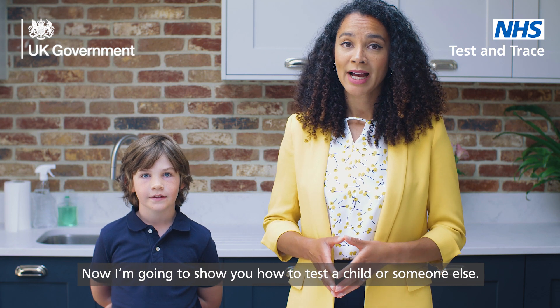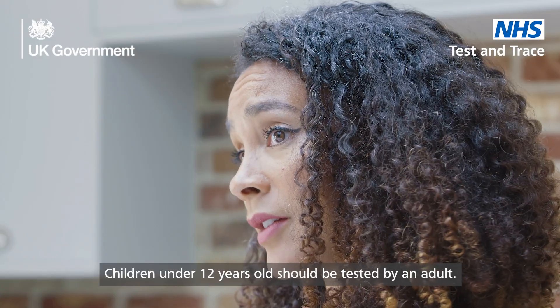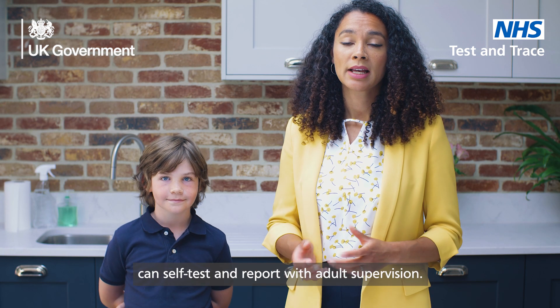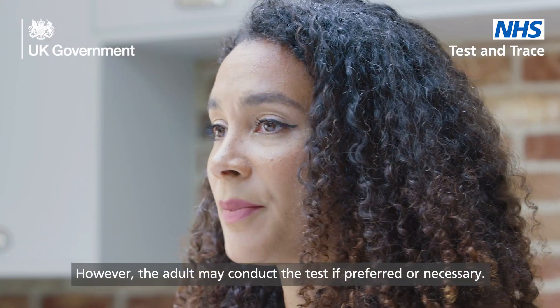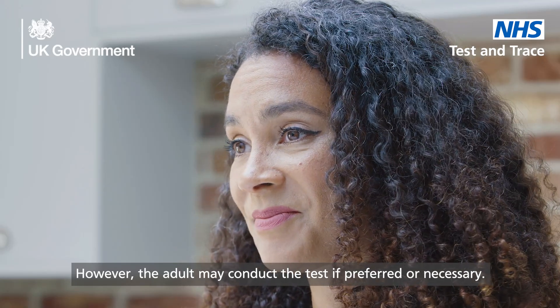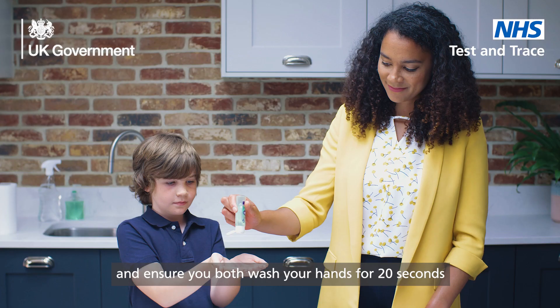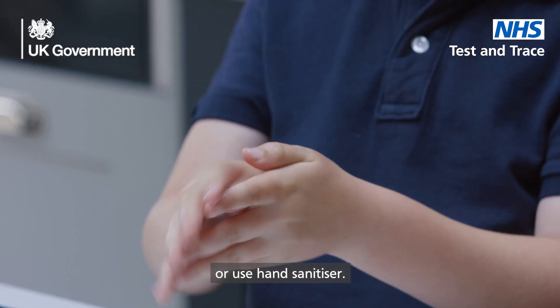Now I'm going to show you how to test a child or someone else. Children under 12 years old should be tested by an adult. Adolescents between the ages of 12 to 17 can self-test and report with adult supervision; however, the adult may conduct the test if preferred or necessary. If you are testing a child or someone else, help them blow their nose if necessary. Ensure you both wash your hands for 20 seconds or use hand sanitizer.